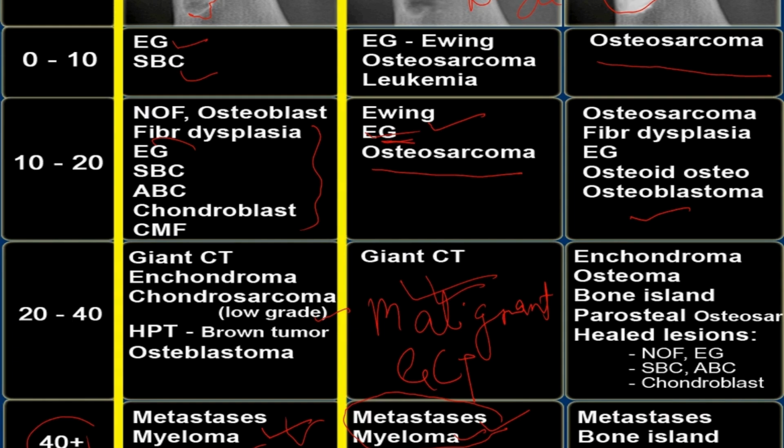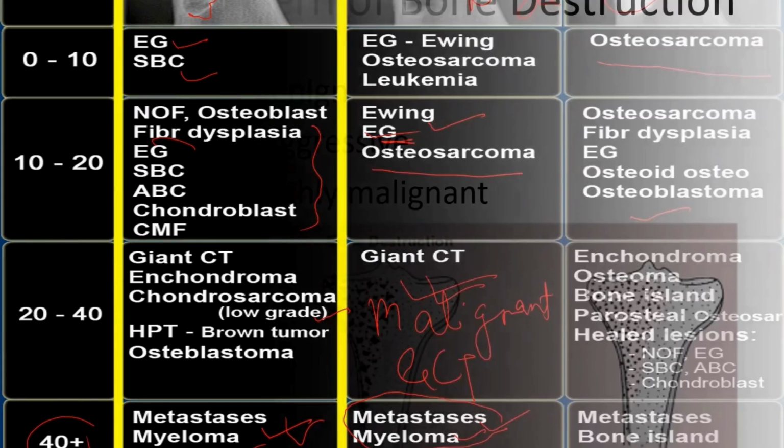And chondrosarcoma, so high-grade chondrosarcoma shows ill-defined margin, whereas the low-grade chondrosarcoma can show the well-defined margin. And sclerotic lesion can be seen in the metastasis and bone island. In all age groups, infection can show both well-defined or ill-defined margin, whereas the healed infection can show the calcification.